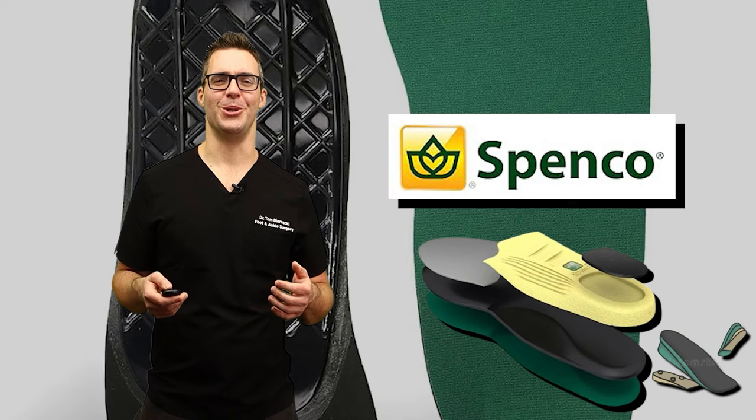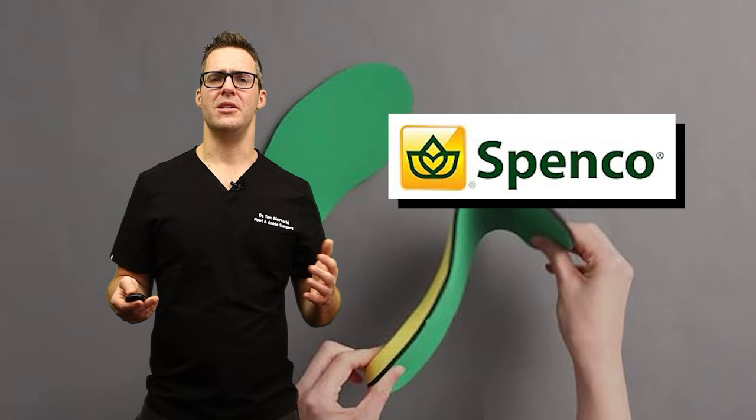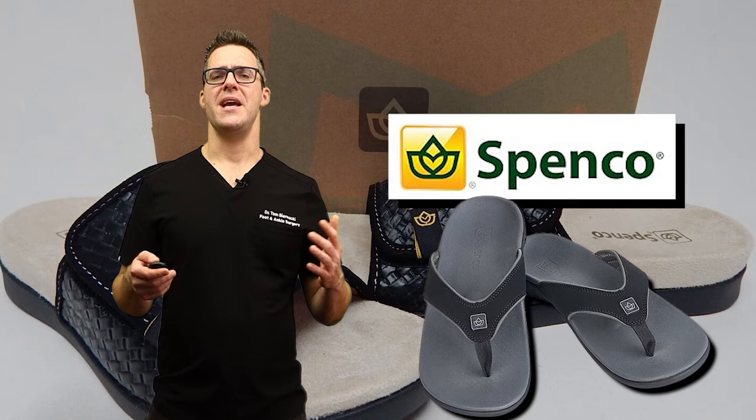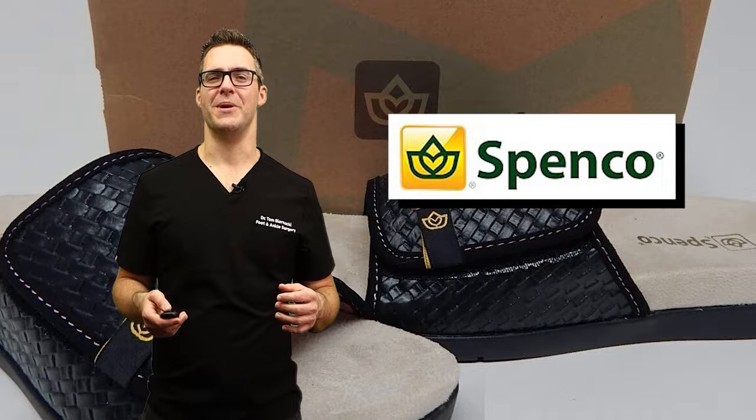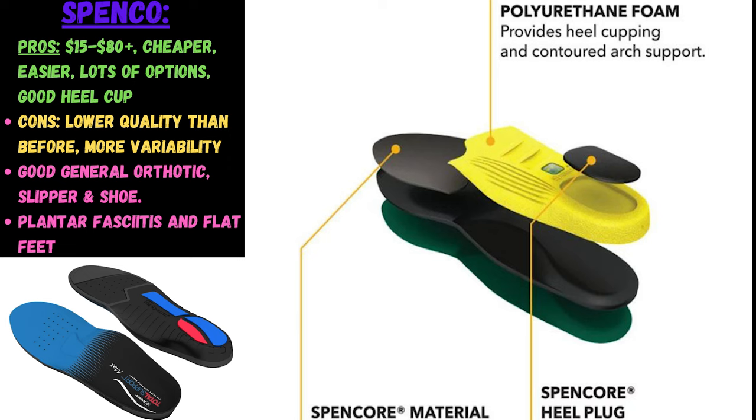Spenco — I personally used to love Spenco. I'm a big fan, but I think they went more commercial and developed a lower range and a higher range insole. I don't think they're quite as high quality as they used to be, but they still make pretty good insoles and arch supports that reduce discomfort. They target plantar fasciitis and overpronation, make sandals and slippers, and are praised for durability. Overall, Spenco is a pretty reliable option at a lower price point.